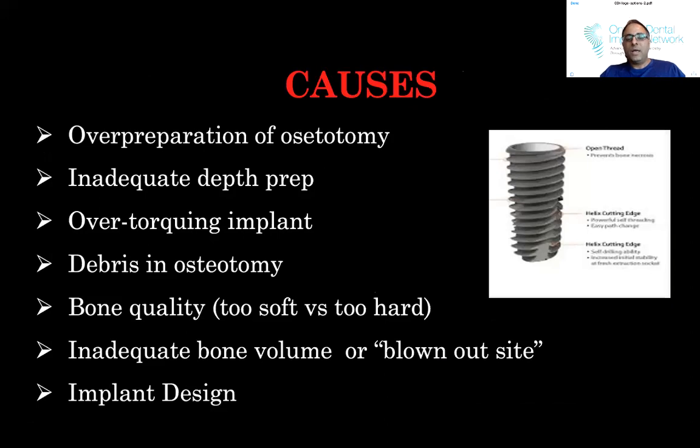So the causes: if you prepare the osteotomy too large. As I mentioned, when you're preparing an osteotomy, especially when you're a beginner, it's like a marriage, right? You're sitting in that site too long when it really needs to be like a one night stand. You need to be in and you need to be out. Otherwise your 3.5 size hole becomes a 4 millimeter hole really quick.